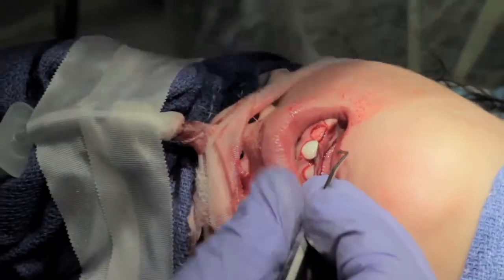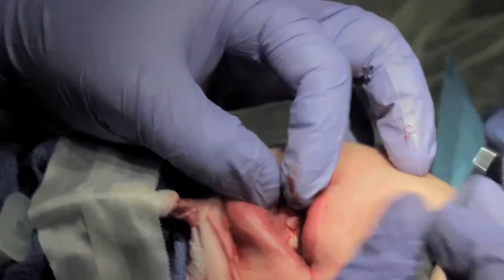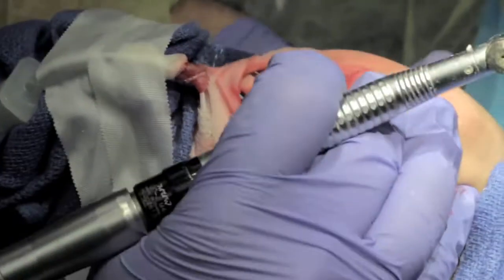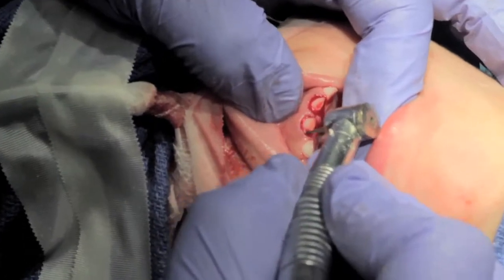Take those off. You want to try not to remove them from the tooth from the facial because you can scratch the facing. I'm going to take a tiny bit more off of E just to get it to go down a little bit straighter.